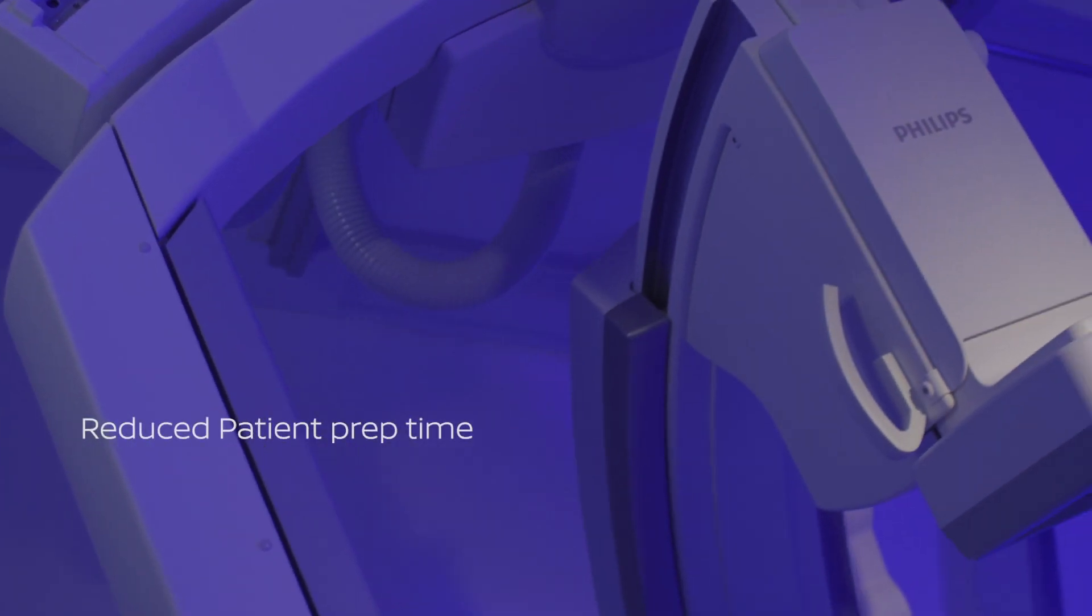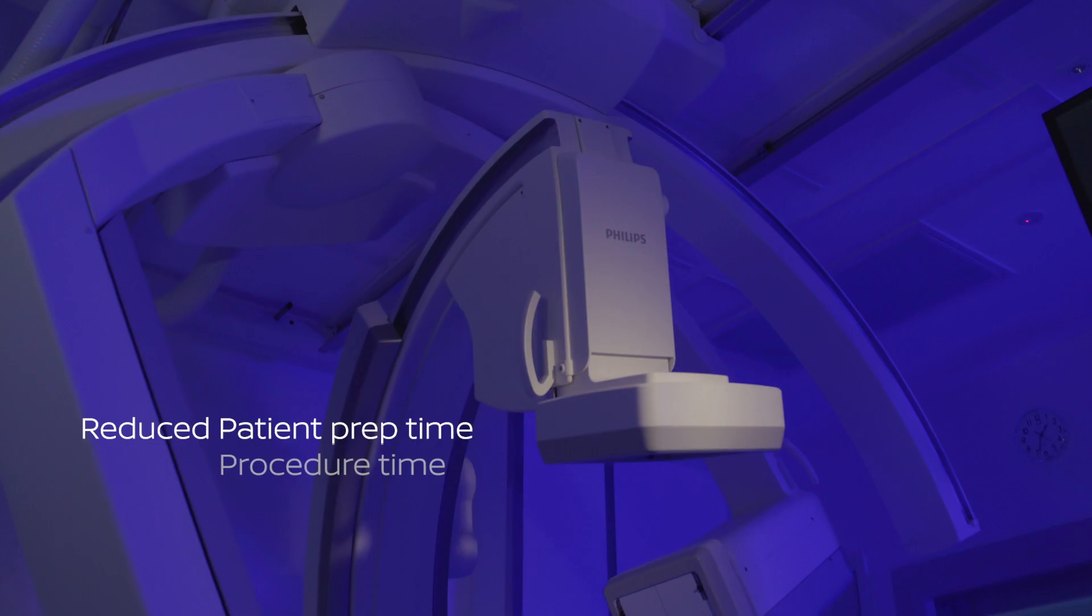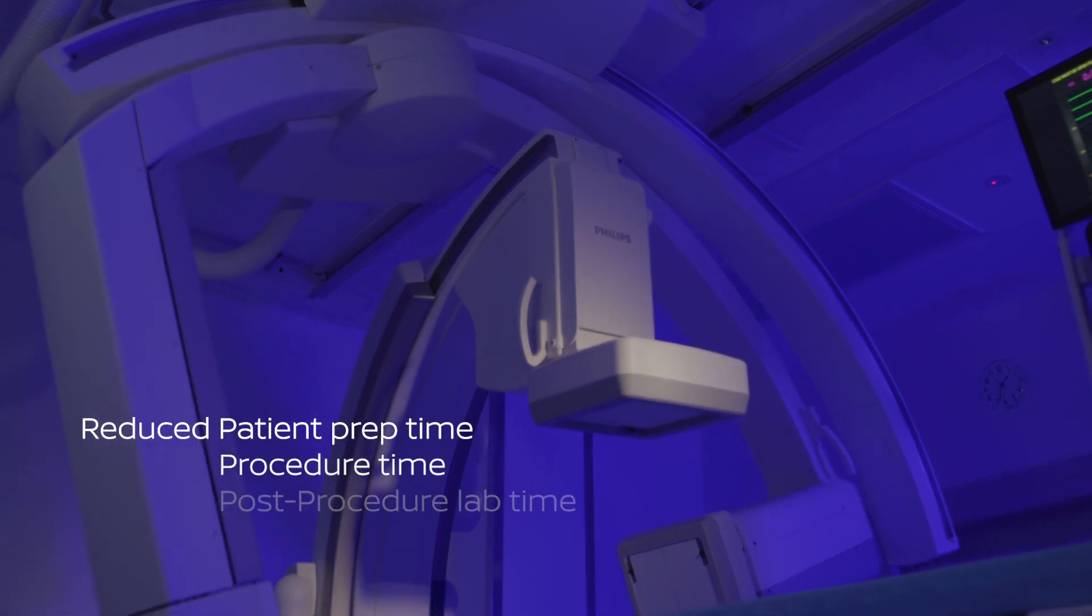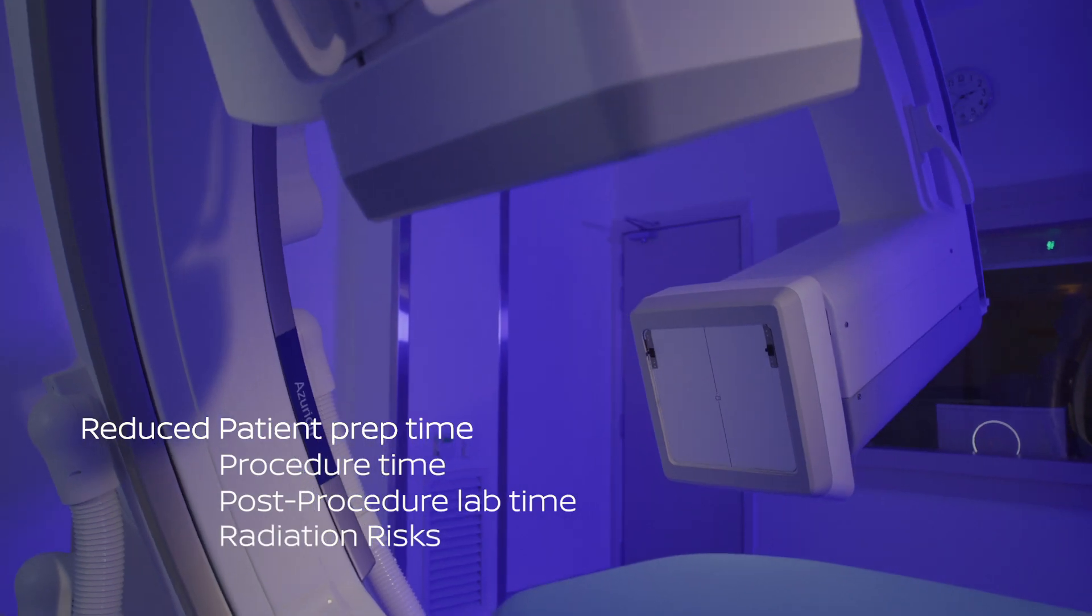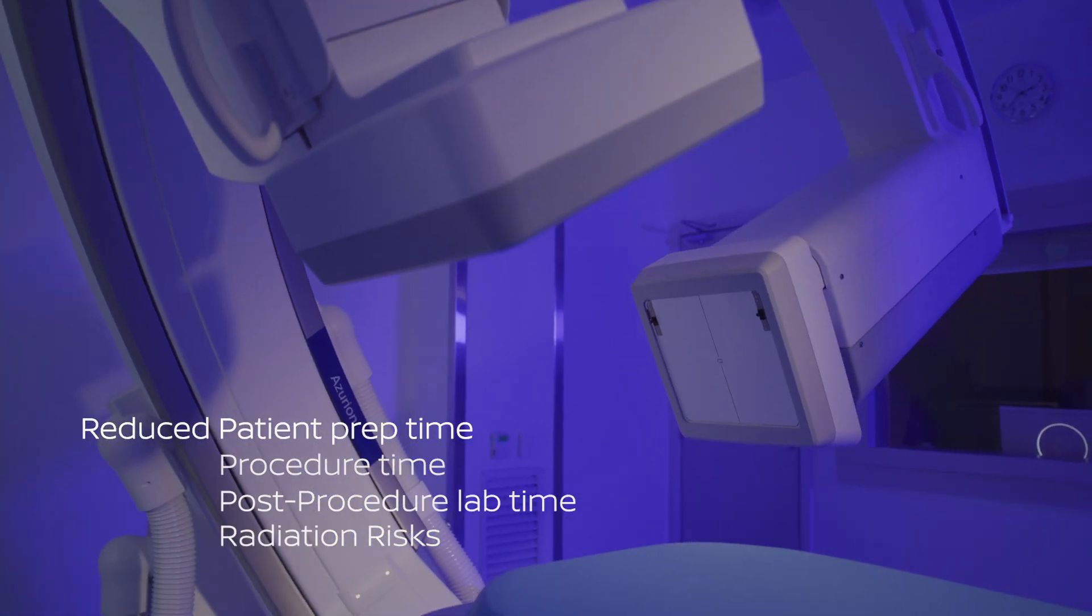Phenomenally reducing patient time, procedure time, post-procedure lab time, and reduced radiation dosage.